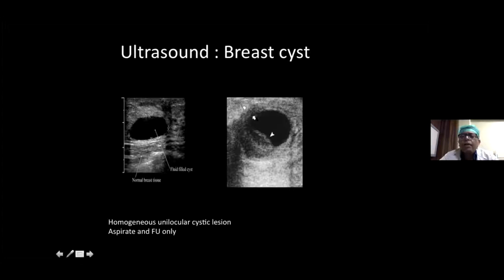And in certain cases, I am sure you are going to have these small solid lesions propping up from one of the corners, mandating some sort of intervention in terms of a guided core biopsy. For God's sake, don't go for a blind core because you're going to aspirate only the fluid. So a guided core which goes into the solid component and takes it out is going to clinch the diagnosis, and quite often it might come out to be a papillary carcinoma of the breast.